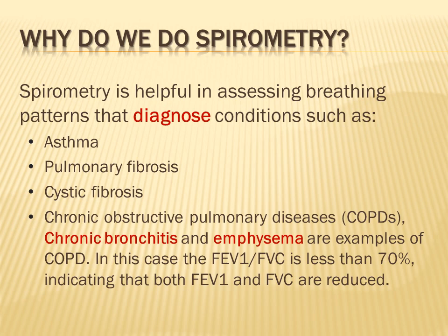With spirometry, we can diagnose these cases because spirometry will show us that the forced expiratory volume in the first second divided by the forced vital capacity is less than 70%. I will demonstrate that to you soon.